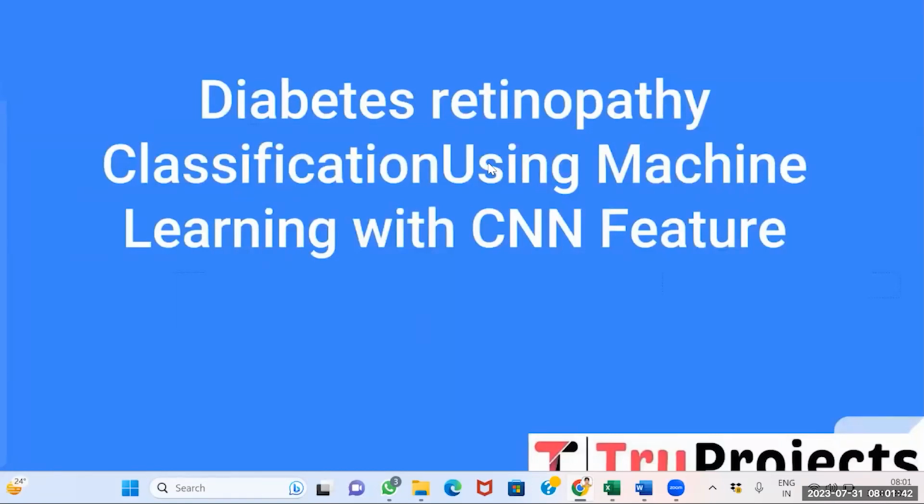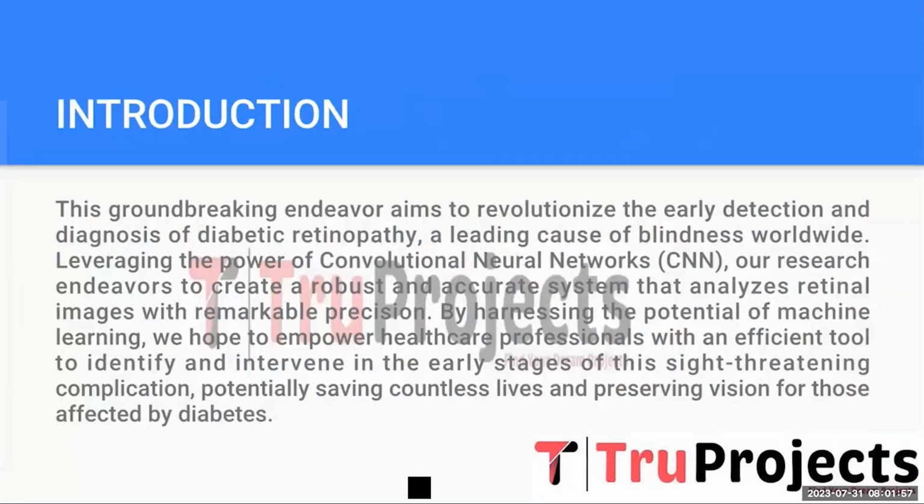Projects. In this video, we are going to explain a project titled Diabetic Retinopathy Classification Using Machine Learning with CNN Features. Diabetic retinopathy is a leading cause of blindness worldwide, necessitating early and accurate detection for effective intervention. In this project, we harness the power of convolutional neural networks for feature extraction and integrate various machine learning algorithms, including KNN, random forest, and many more.